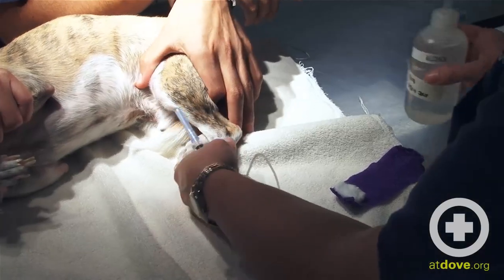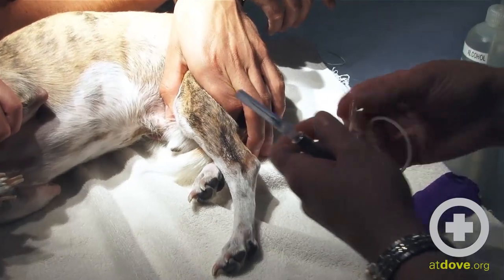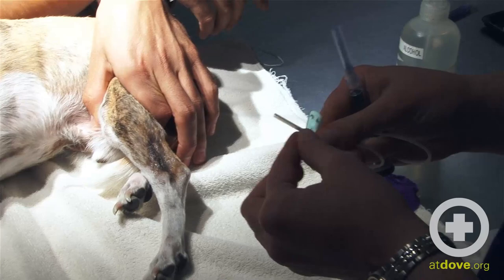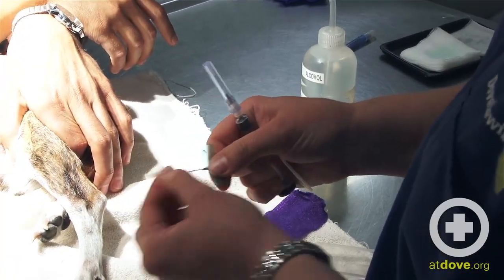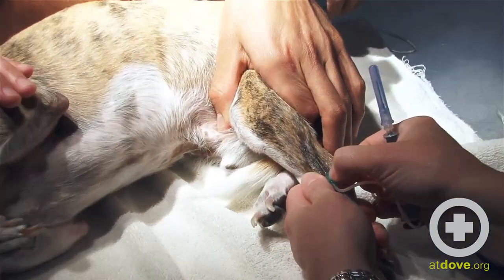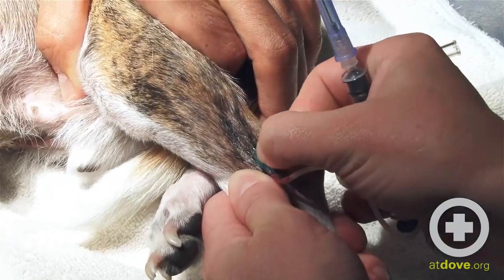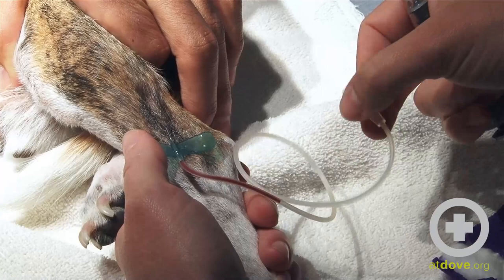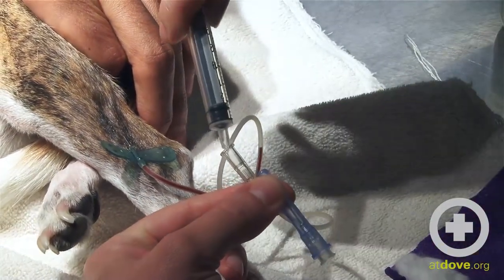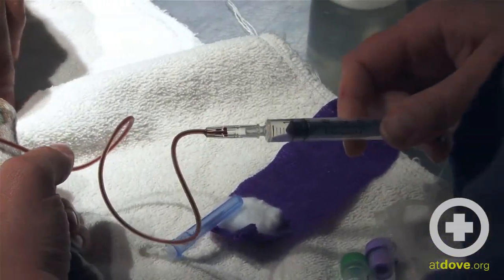So I'm going to start by just putting a little bit of alcohol on the vein here. Then I'm going to take the cap off the end of the butterfly and hang on to that. Loosen the needle on my syringe. So once I get a good flow going through there, attach the syringe to the end here and then just draw back.